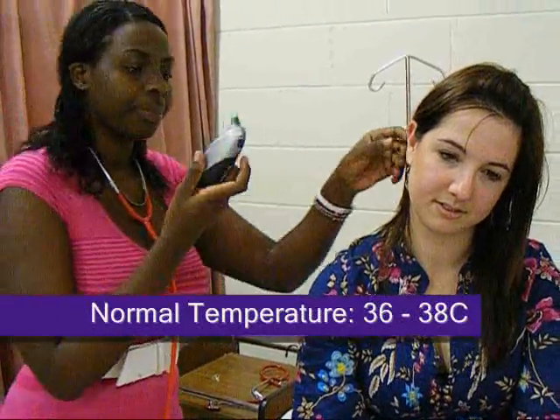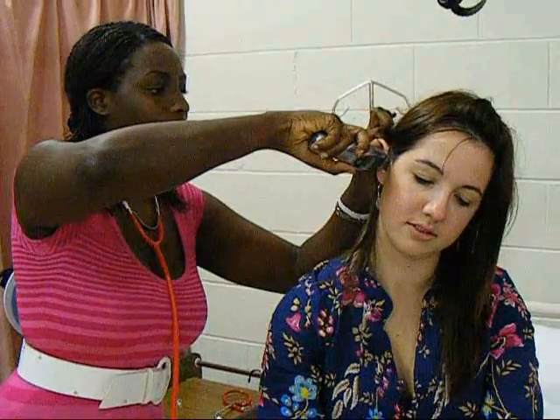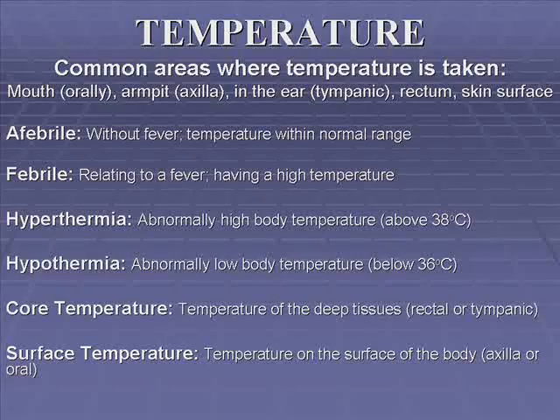Check the ear for any wax so that you may not get a wrong reading. Cover the probe tip with a new probe cover. Gently place the covered probe tip in the person's ear canal — do not force it in and do not occlude the canal. Activate the device by pressing the button behind it. Read the temperature in two to three seconds.